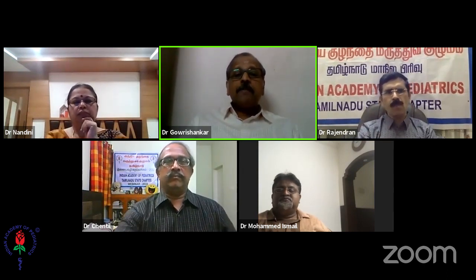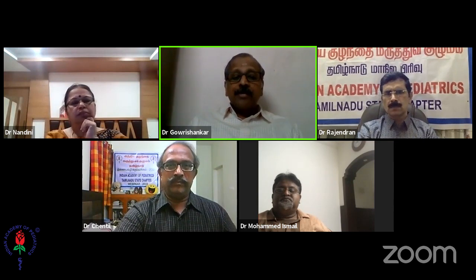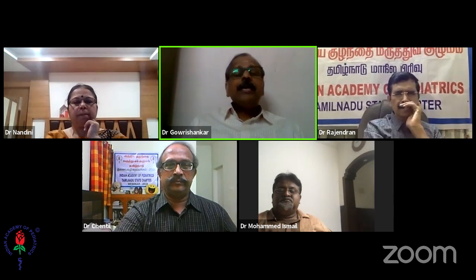This is how a lipoid pneumonia looks, but all these are subjective. But you are a clinician, you get the history, then you look at the X-ray. With only an X-ray, it is very difficult to make out whether it is lipoid or viral, unless the lipoid pneumonia is extensive.